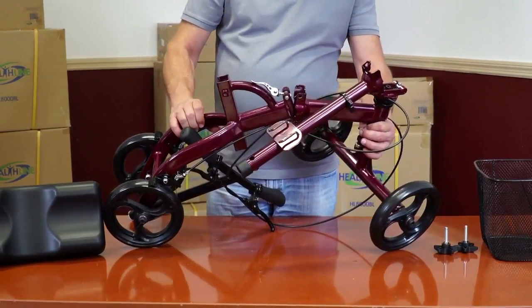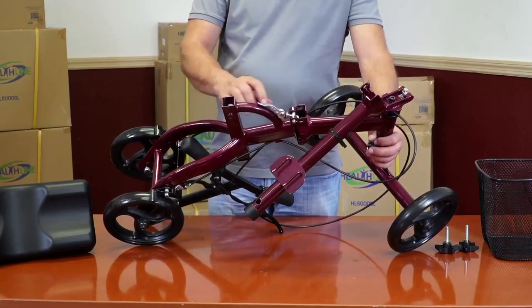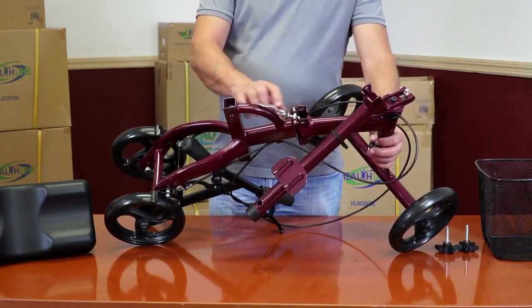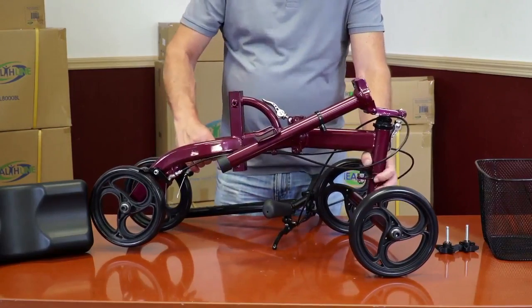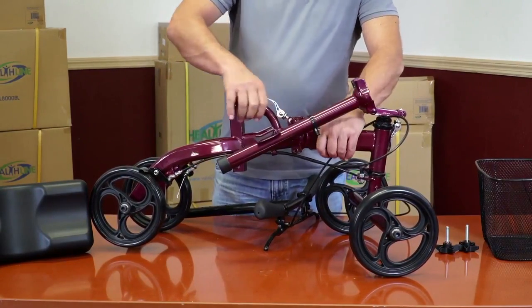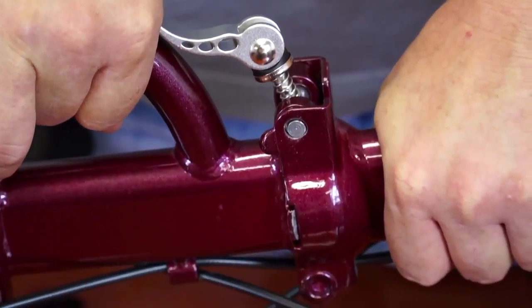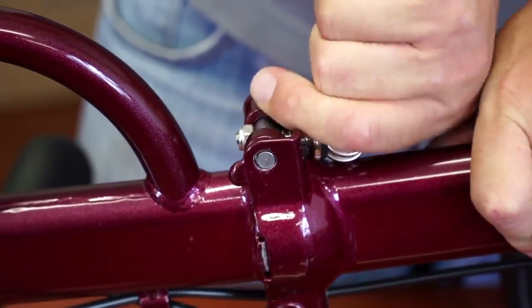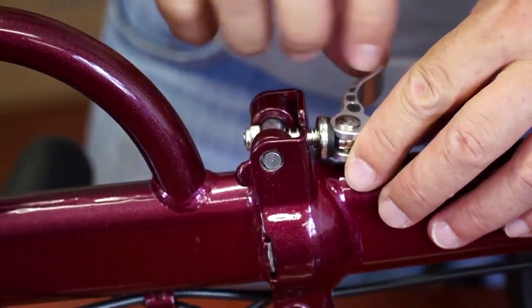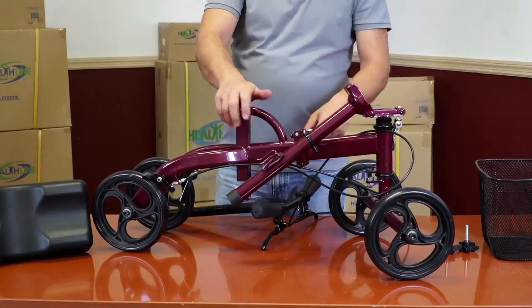Begin by setting the mainframe assembly on a sturdy flat surface, wheels down. Grab both parts of the frame close to the center and push down swiftly to lock them into place. Secure the frame with the spring-loaded locking mechanism by pushing it forward into the groove and flipping the top part all the way to the side as seen on the video. The frame is now secured.